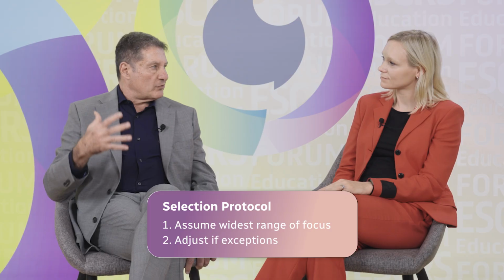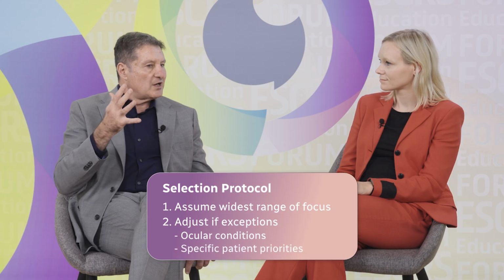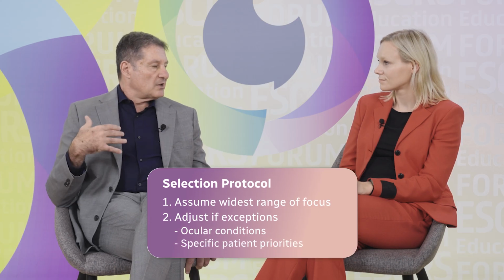What is going to prove something different? First of all, ocular conditions, but excluding ocular conditions, it is what the patient wants. Because for those who are addicted to near vision, putting in a lens that does not allow that distance is going to be detrimental to them.